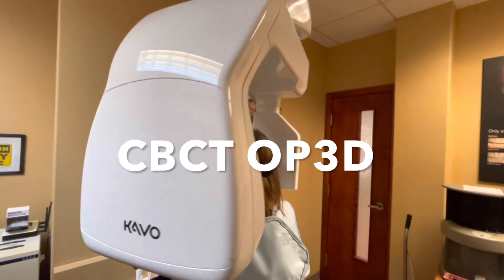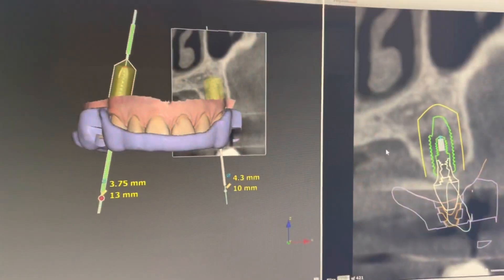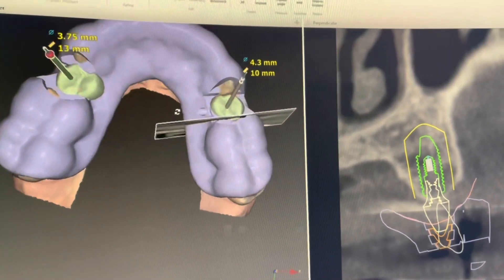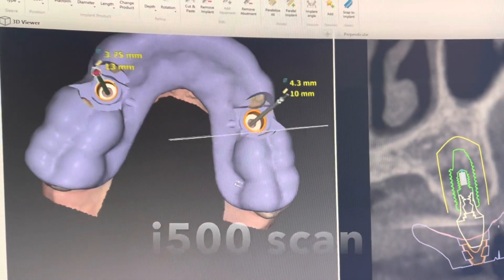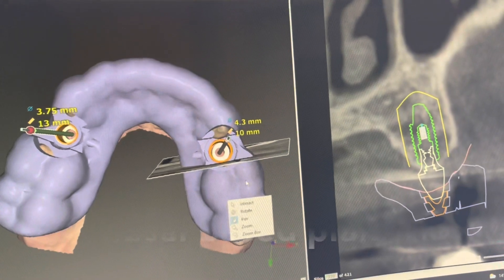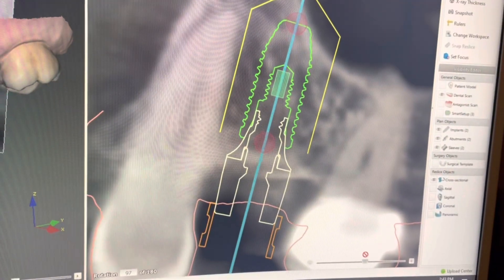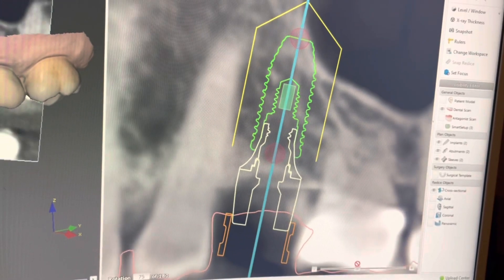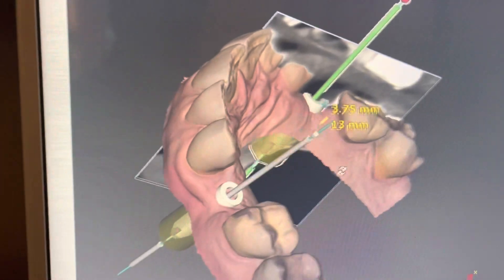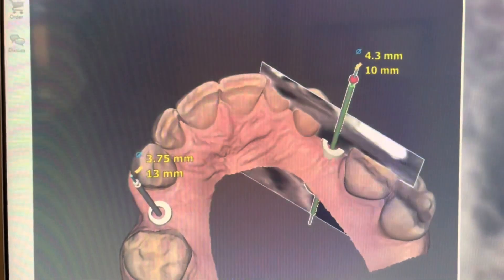Let's have a look at a case. About three months ago we did a CBCT x-ray and then blended it with an i500 scan. The CBCT scan and the intraoral scan were blended together — this is the i500 scan and you can see how beautiful it was. We did occlusal-based planning and wanted to plan some On1 abutments, with angles hitting the buccal cusp of the lower teeth. This is all planned from bone and from occlusion. We used a color PLY file which looks very realistic, and you can see where the On1 abutments' angulation, depth, and position are planned.